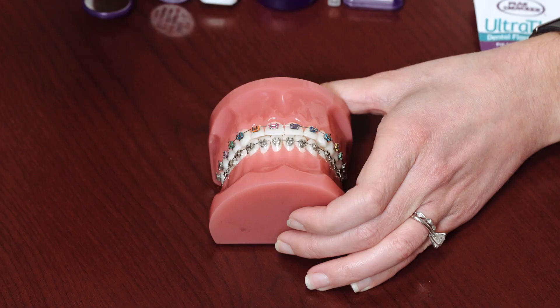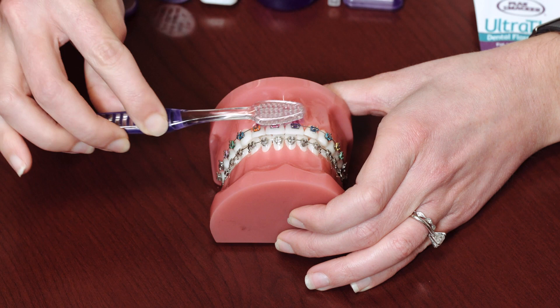Now let's take a look at your appliances. It's important to realize that there are four sides to every bracket and we have to clean all four sides. First we'll start with our regular toothbrush — to clean the top and bottom halves of the bracket, you'll point your bristles gently towards your gum line and go in small circular motions.